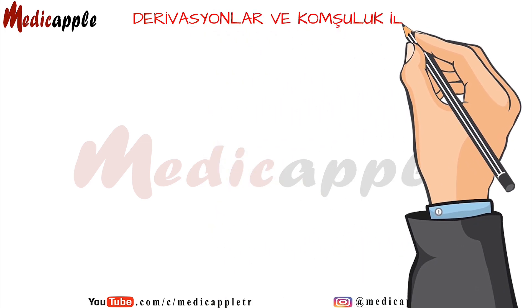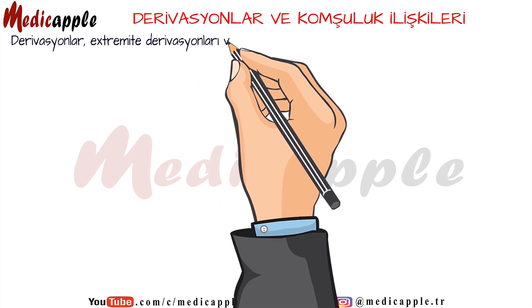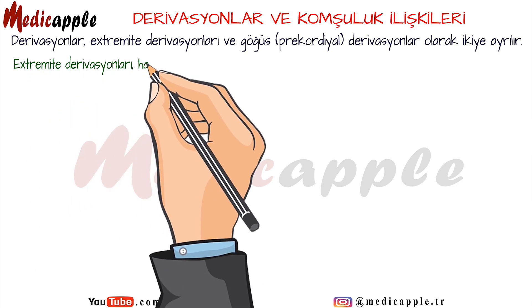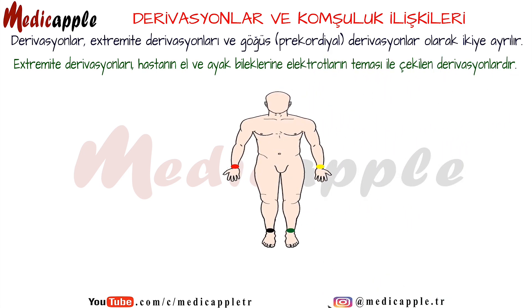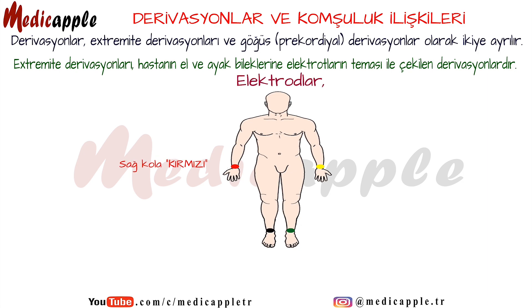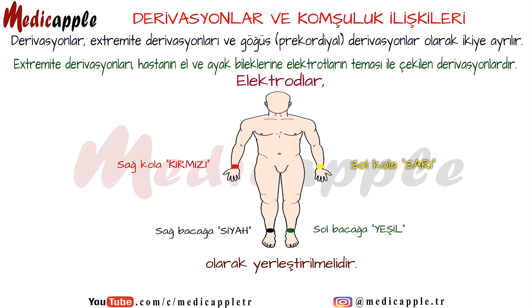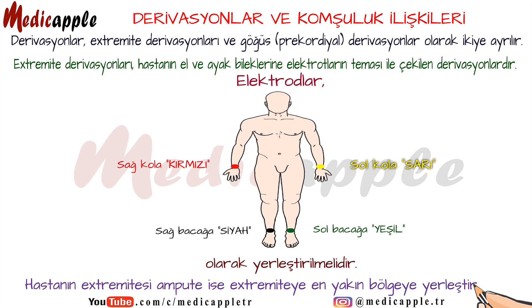Derivations are divided into two: extremity derivations and chest precordial derivations. Extremity leads are leads taken by contact of electrodes to the patient's wrists and ankles. Electrodes should be placed as red on the right arm, yellow on the left arm, black on the right leg, and green on the left leg. If the patient's extremity is amputated, it can be placed in the area closest to the extremity.